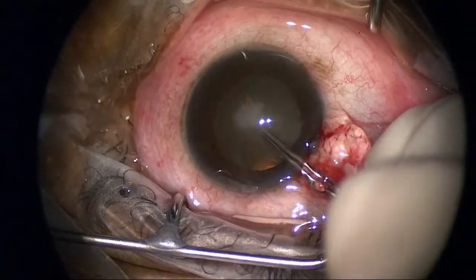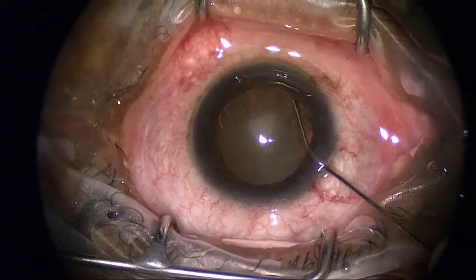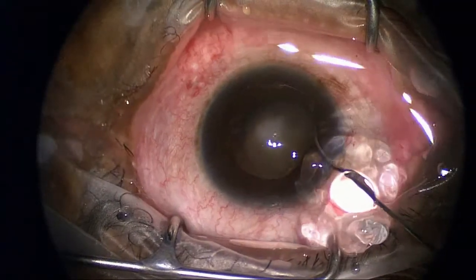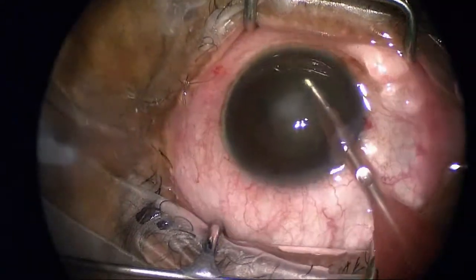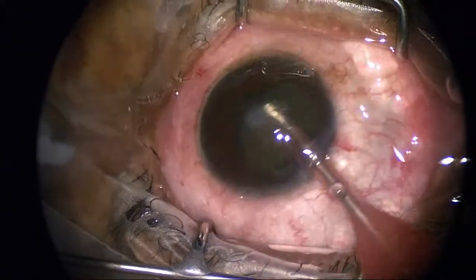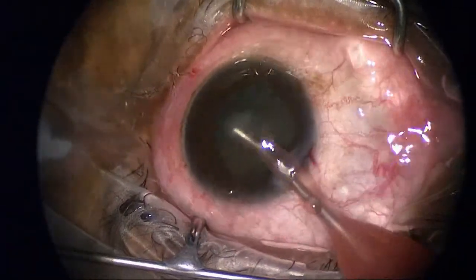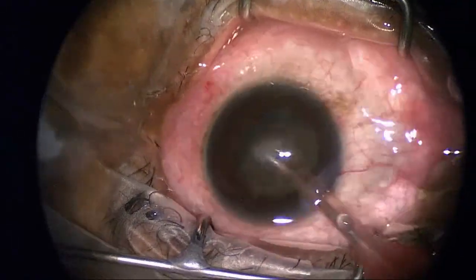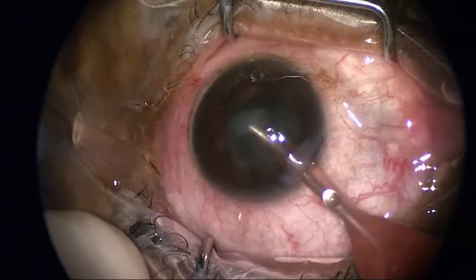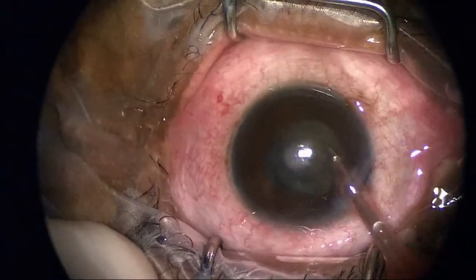You can see I'm performing a capsulorhexis here followed by hydrodissection and then cataract removal. It's not so critical that we worry about the corneal endothelium, as this is going to be replaced in this patient with Fuchs corneal dystrophy. That central area is a bullous lesion I'm going to remove at the end, and I'll explain why.